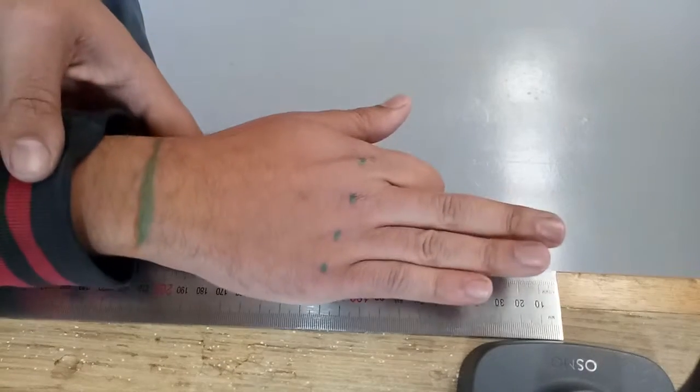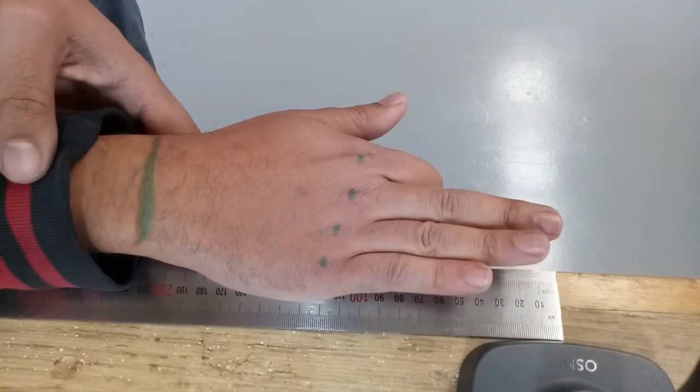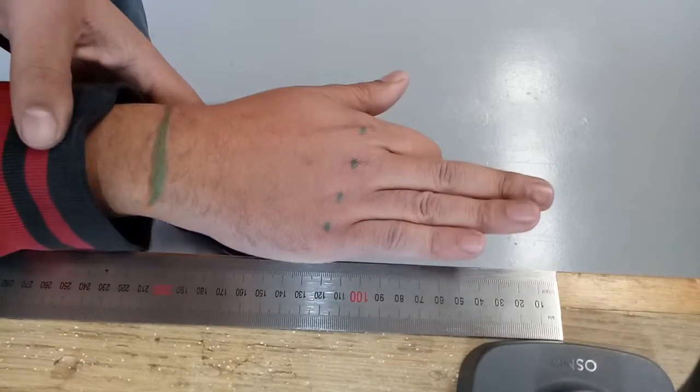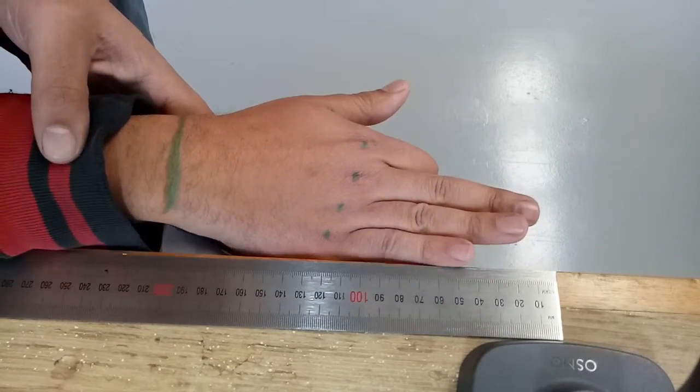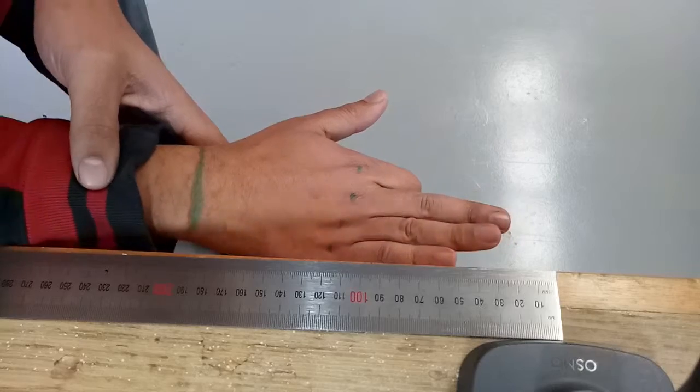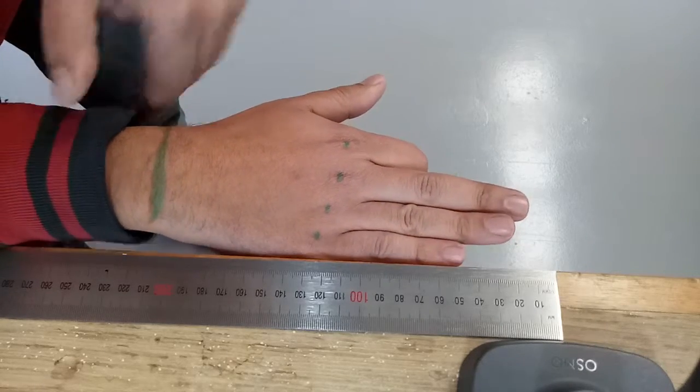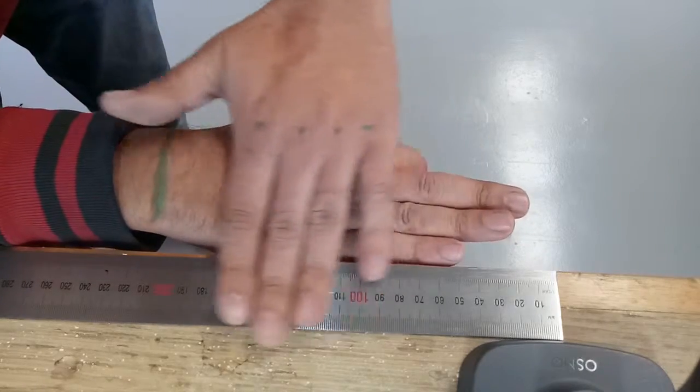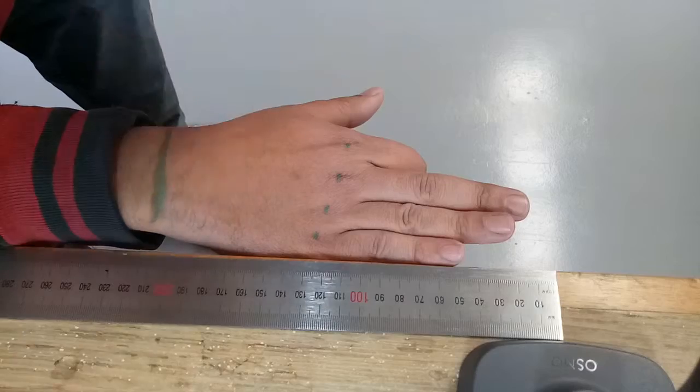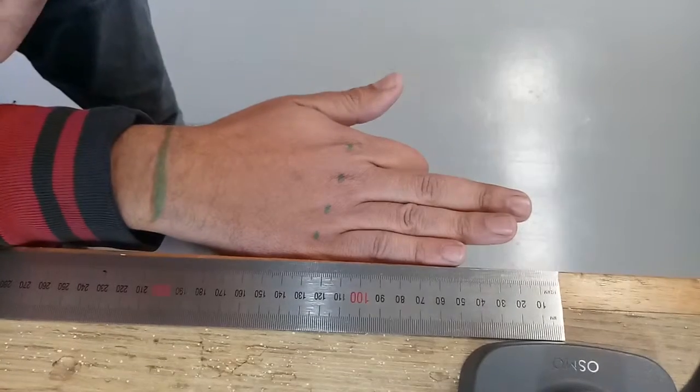If the hand is on the table, as you can see the hand looks bigger in scale to the ruler and vice versa. So it's really important to take a photo level with the top of the ruler and from directly above.